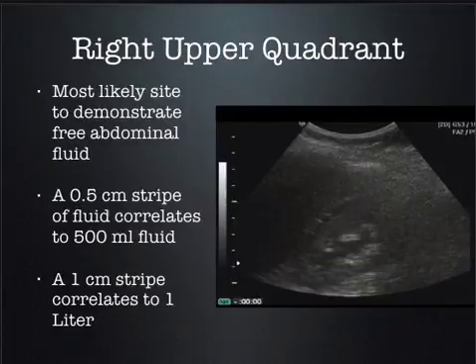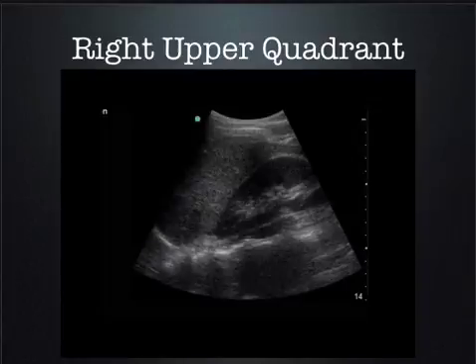Is that a lot of blood? Yes. And from here to here is a centimeter, so if you had a stripe that was a centimeter, that would be about a liter of blood. Is that a lot of blood? Absolutely. Yes. Here's another exam.